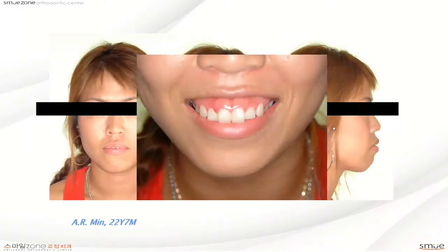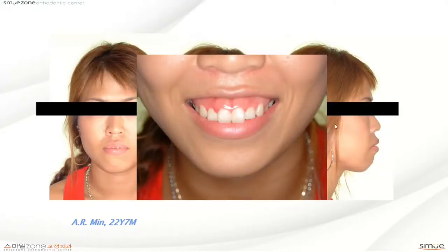Okay, another case is for gummy smile. Следующий случай, десневая улыбка. I saw that Dr. Elena Kim posted deep bite cases with intrusion using miniscrews. Да, я показывала случай по интрузии с помощью мини-винтов.